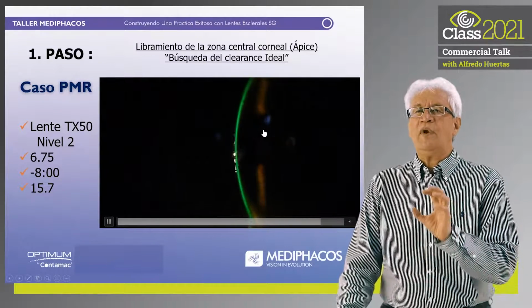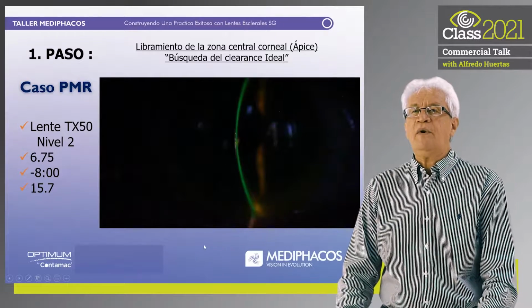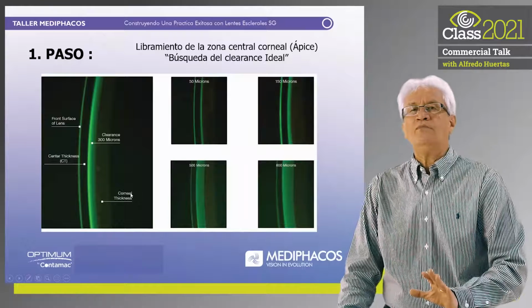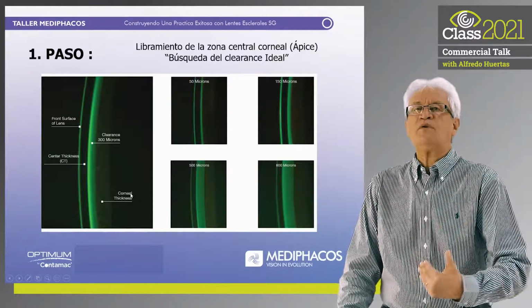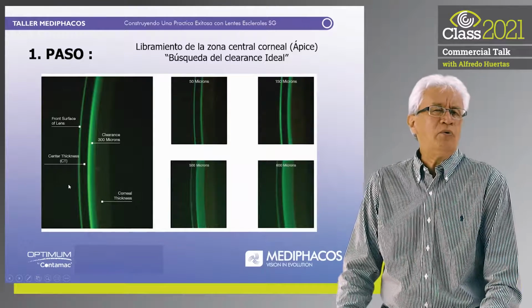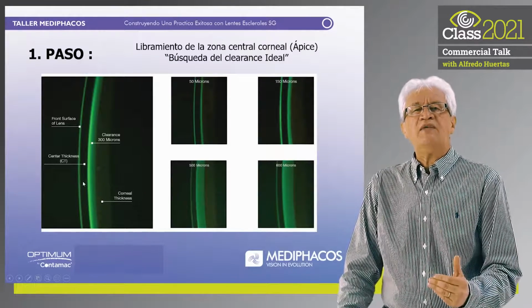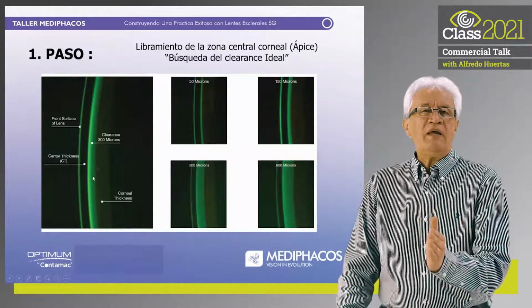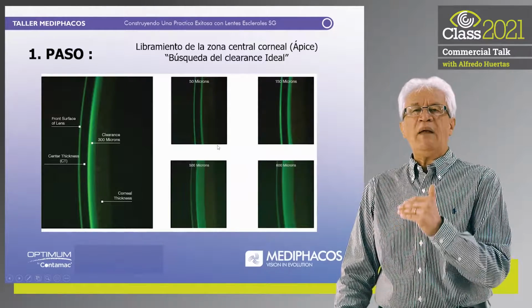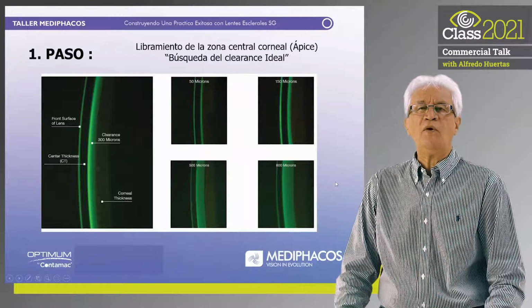These are observations that are made within the adaptation, and it is necessary to leave the patient with the lens for at least 2 hours to observe these findings. Let's review a little. The clearance of the central area of the lens with the cornea is done by comparing the thickness of the cornea and the clearance. Now usually the scleral contact lenses have thicknesses between 0.3, 0.35 and 0.4 millimeters. And it is a value that helps, in comparison, the search for clearance. Now if we look for a physiological lens that does not alter the corneal metabolism, we have already carried out the first step.